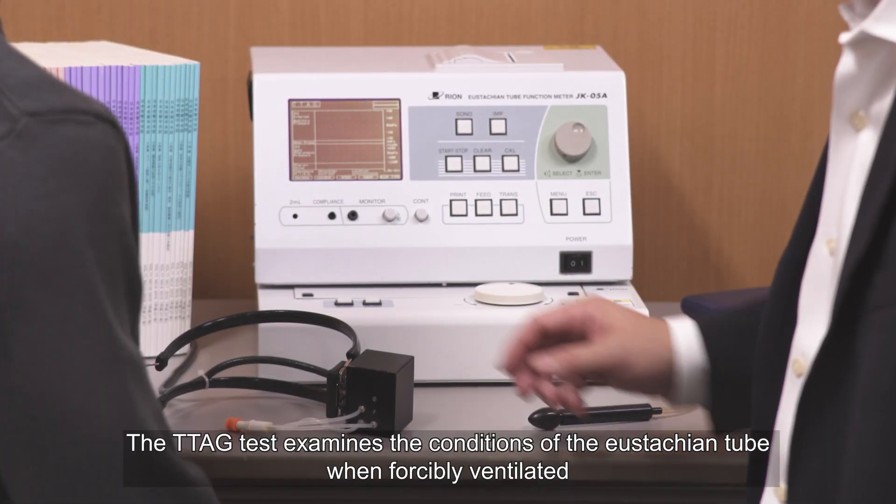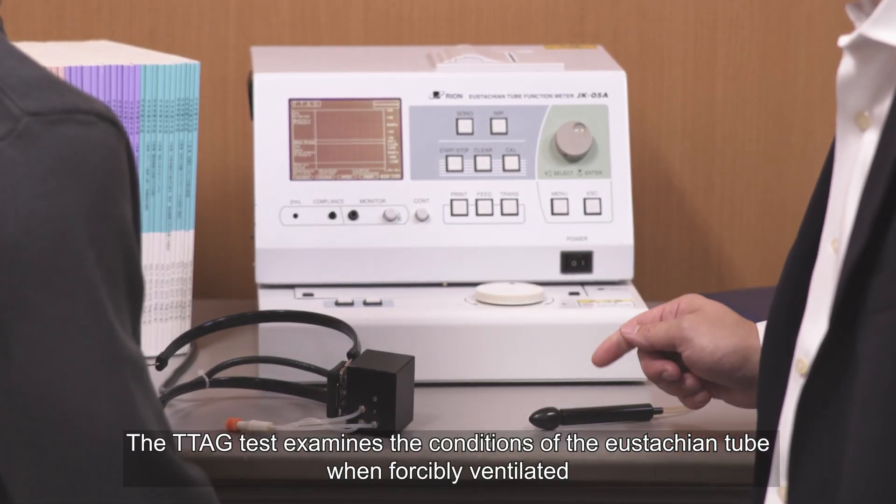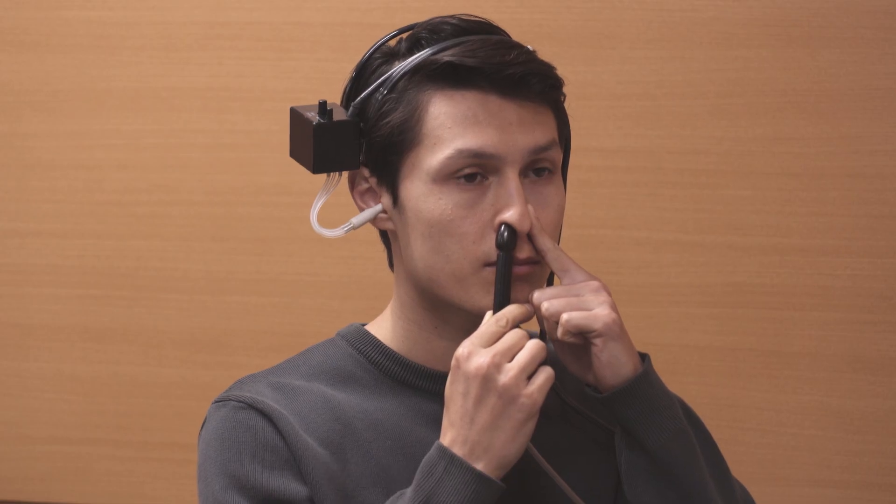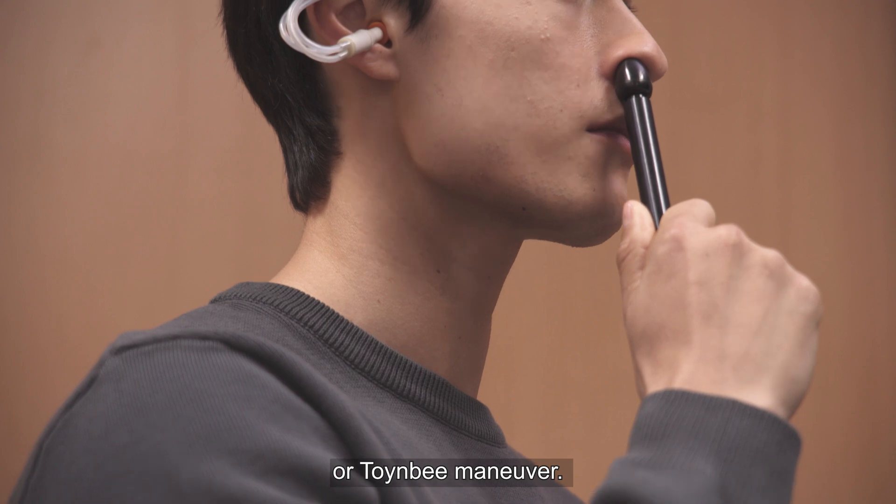The TTAG test examines the conditions of the eustachian tube when forcibly ventilated by the Valsalva manoeuvre or Toynbee manoeuvre.